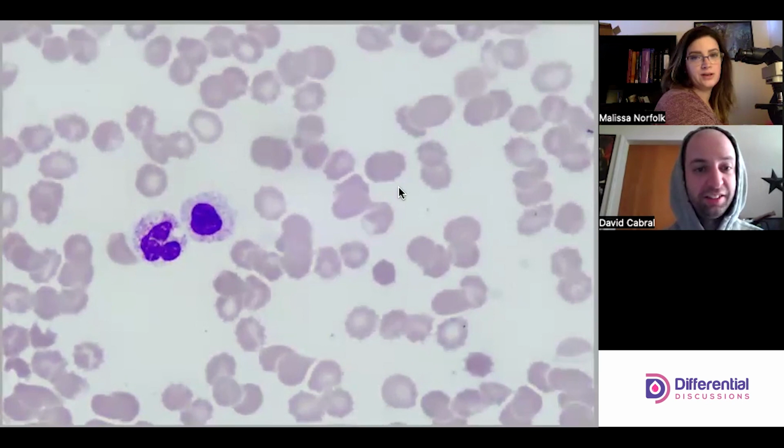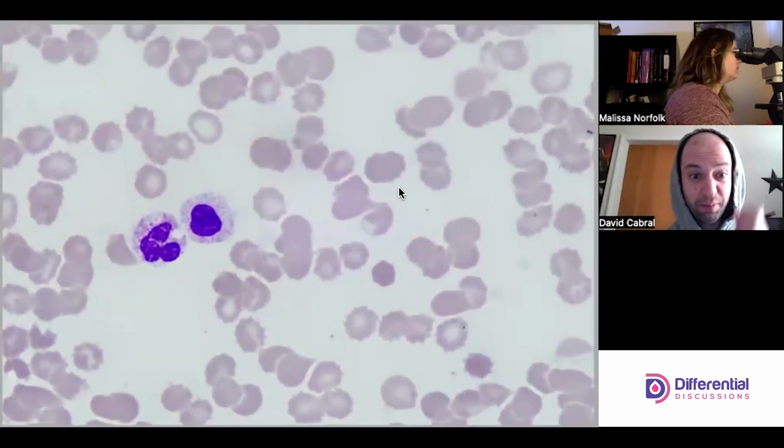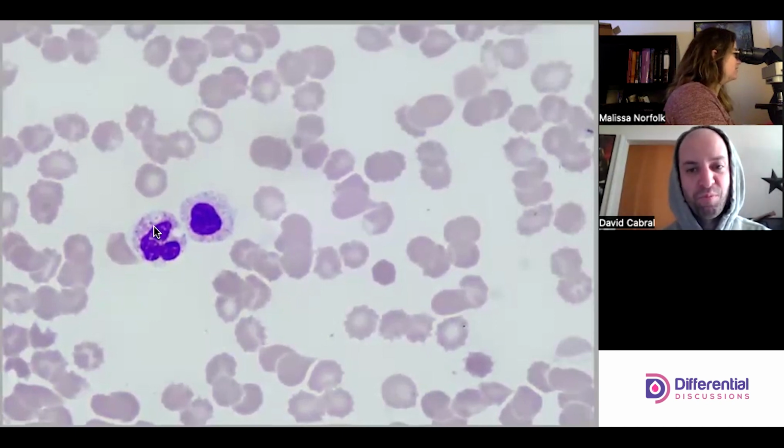I don't think there's anything in them. The vacuoles on the left-hand side look like there's something in there. Again, very subtle stuff. This is not the primary means by which we should be detecting this infection. I don't know if that's anything. Probably not.